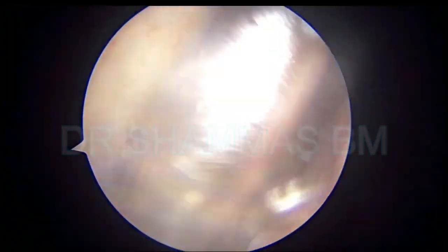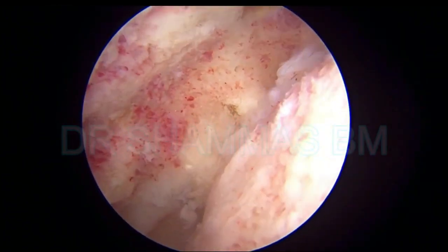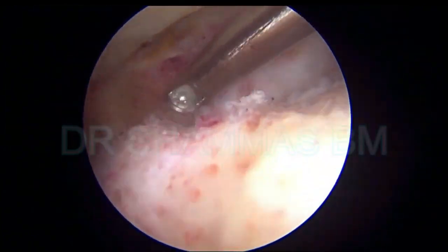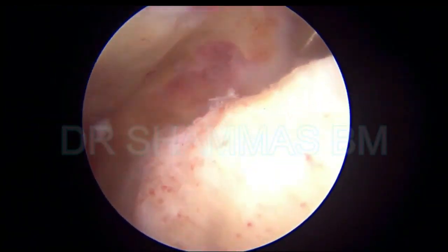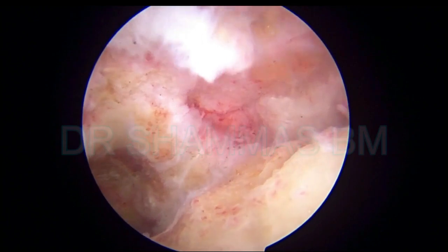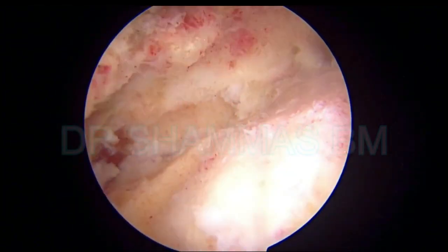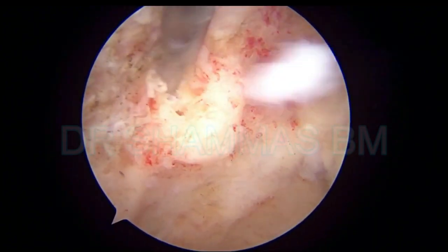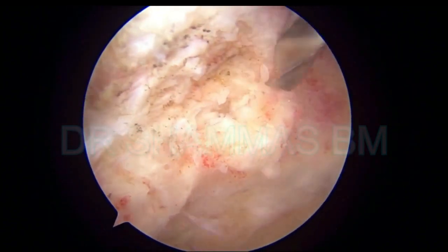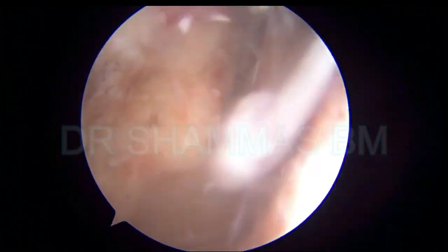Again the burr is coming in on the tibial side. Now you can see that the soft tissues are almost removed and there is bleeding bone. I am using the curette now to remove the soft tissue that is not coming away with the shaver. The curette can also be used — it should be a sharp curette. And for getting some bleeding you have to drill some drill holes. This is on the tibial side where I am drilling multiple drill holes.